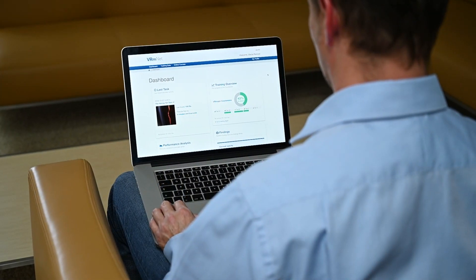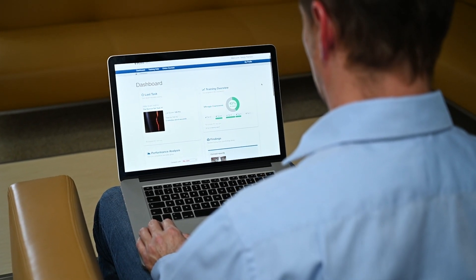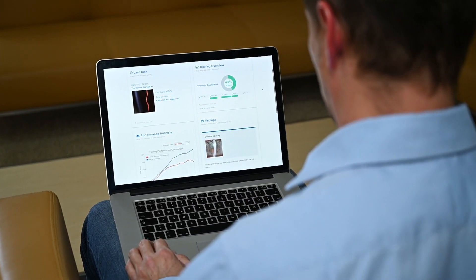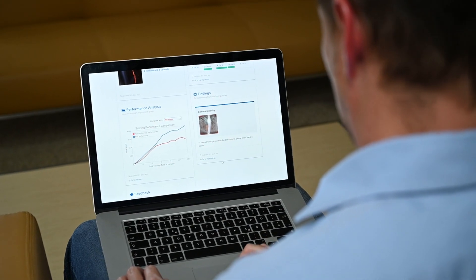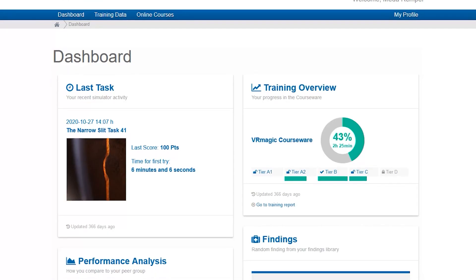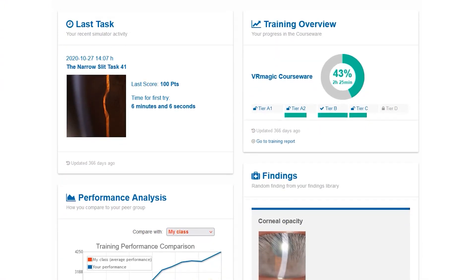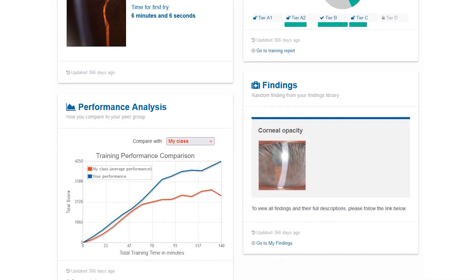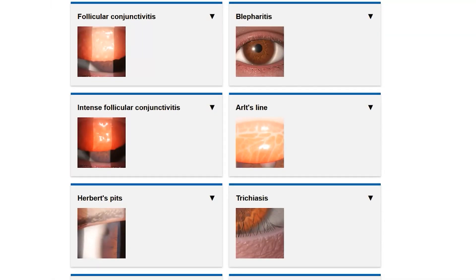The web-based training platform VRM-NET lets trainees access their training data from any browser or mobile device. The personalized VRM-NET dashboard displays the current training status, the findings library, and available online courses.